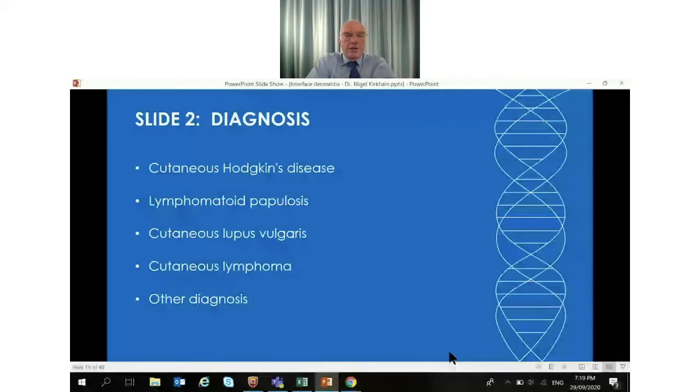So we had a wide differential diagnosis here, so vote for your favored diagnosis, please. How are we doing, Laura? We've got a few answers in so far. Just give them a couple more minutes. Your choices are cutaneous Hodgkin's disease, lymphomatoid papulosis, cutaneous lupus vulgaris, cutaneous lymphoma, or something else.